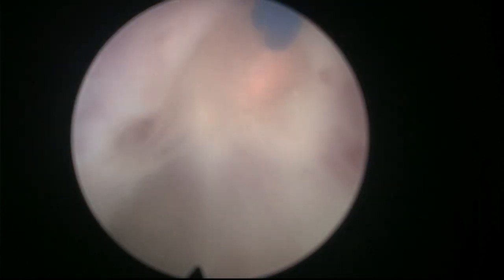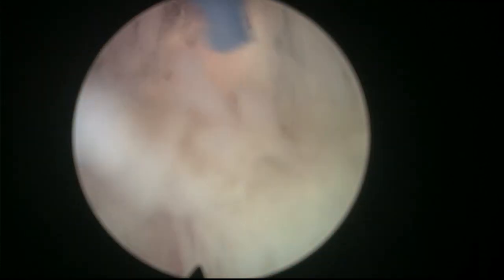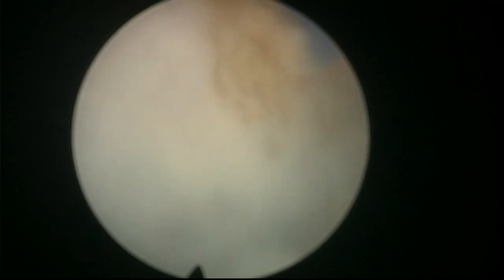and it releases the sphincter from the apex. So we can then follow the proper plane to develop the right plane and release the apex from the posterior to anterior. So I'm coming up. Of course, here you want to come out and see what's going on. Here, again, it's better to cut a little bit under the sphincter. You see, I'm cutting here under the sphincter, very horizontally up here, because I want proper access first. So now when we have access, and we can gradually separate the sphincter from the apical tissue, then we're going to look for the good plane anteriorly.